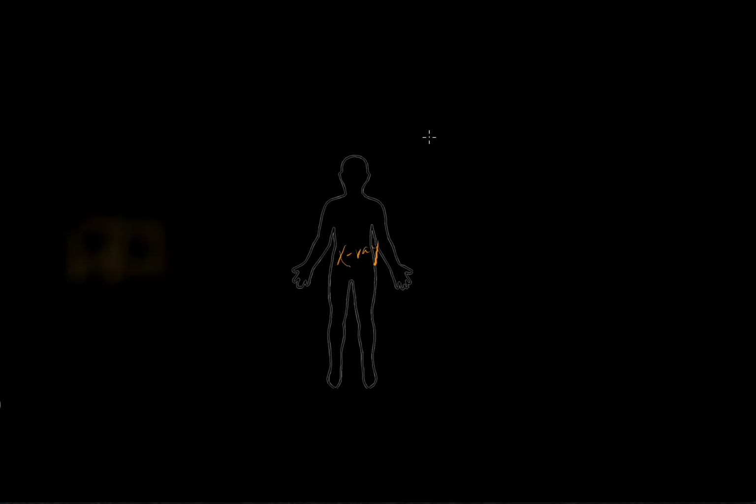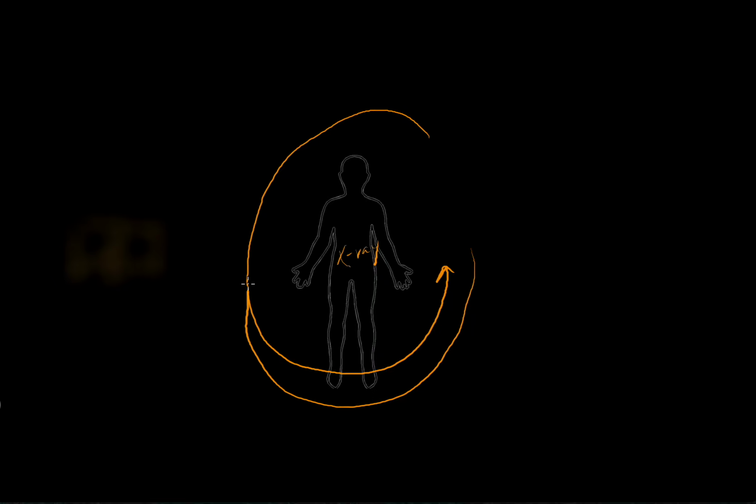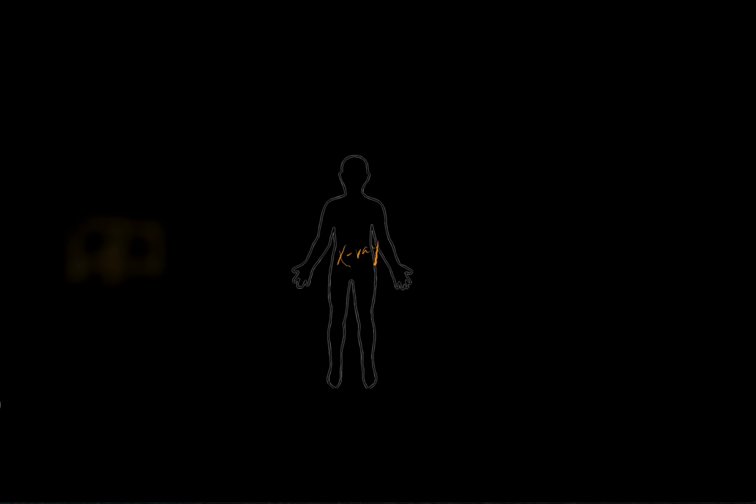Now, the image intensifier can rotate around the patient in either direction, depending on which view you're looking at the time. There are 6 basic views, all rotating around the patient. In this website, you'll see abbreviations for all 6 of these views.